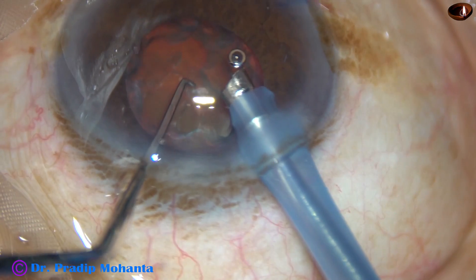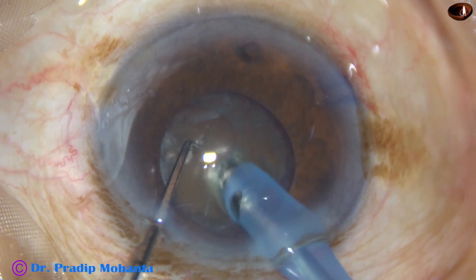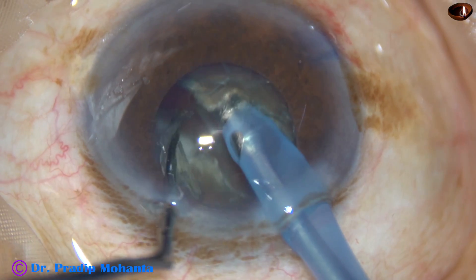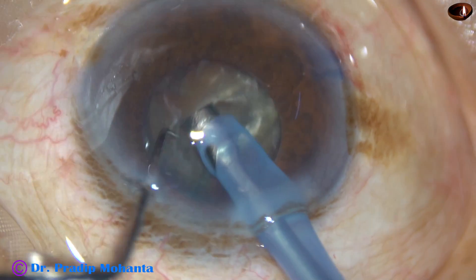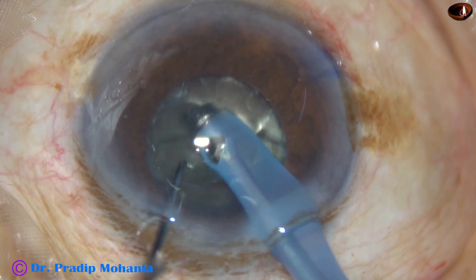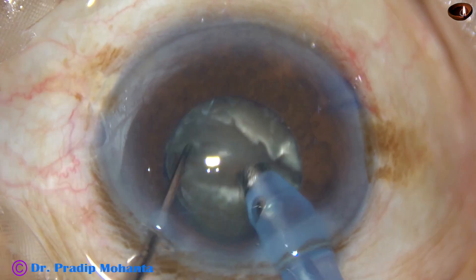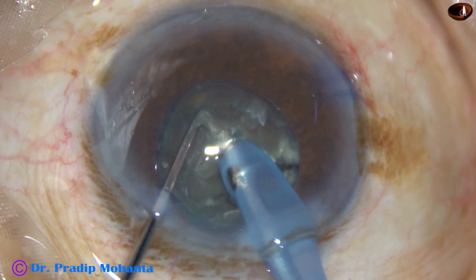Some air bubbles have gone in and those have to be removed. The tip is buried again into the nucleus substance completely, going through toward the opposite equator. After crossing the central part and going a further distance, I try to chop it — and it is a nice crack. I then rotate the nucleus 180 degrees, hold the hemi-nucleus, separate the two hemi-nuclei completely, and now each hemi-nucleus is subdivided into pieces.